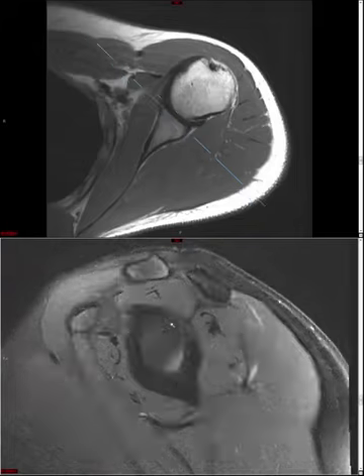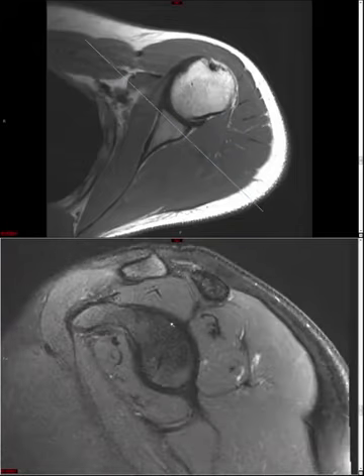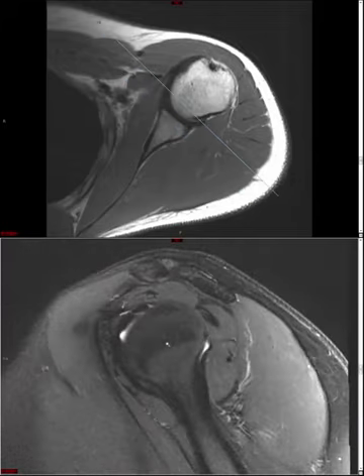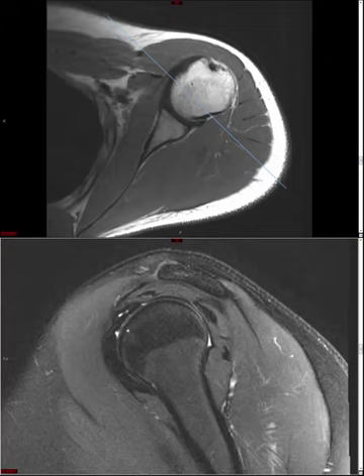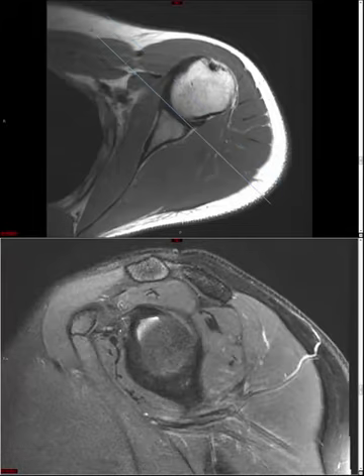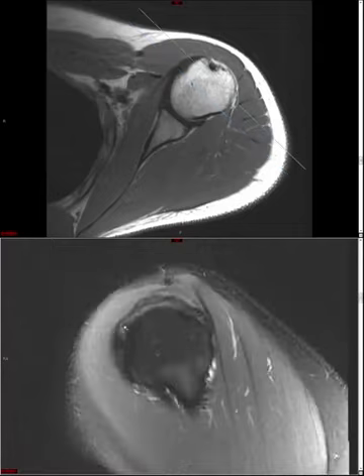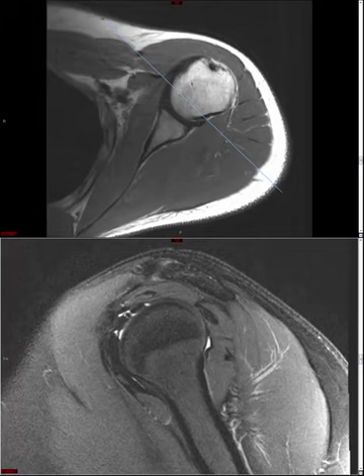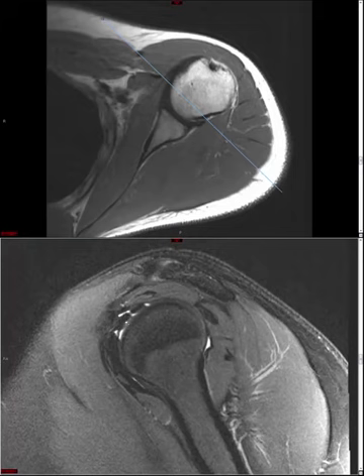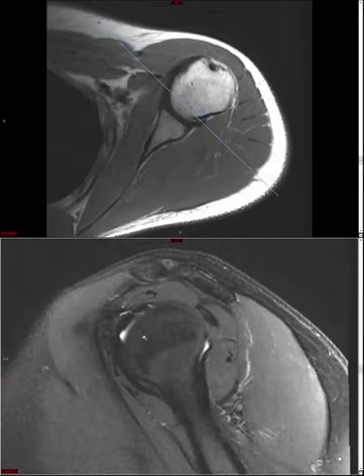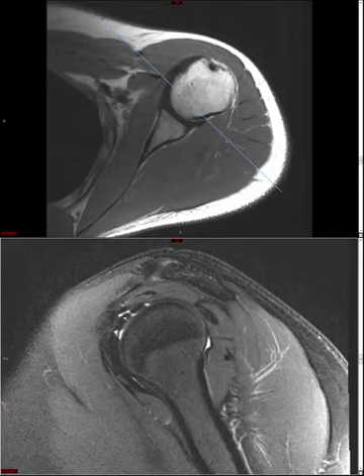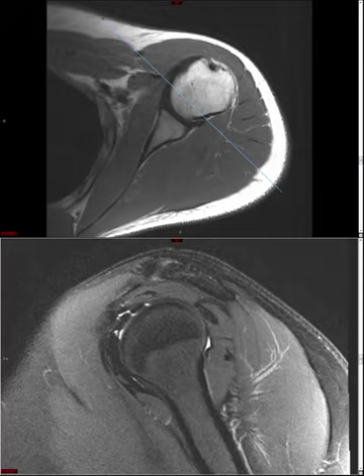The rotator interval is an anatomic space marginated by the base of the coracoid medially, supraspinatus superiorly, and inferiorly biceps, subscapularis, and the humeral head. It's like a triangular prism: the base is at the coracoid, and the apex is where the biceps tendon enters the bicipital groove. The rotator interval also contains a biceps tendon pulley formed by the superior glenohumeral ligament and the coracohumeral ligament, which keeps the biceps stabilized and prevents anterior subluxation.